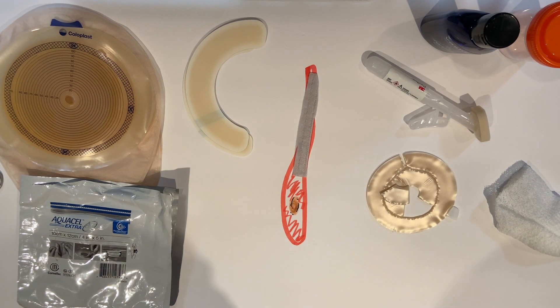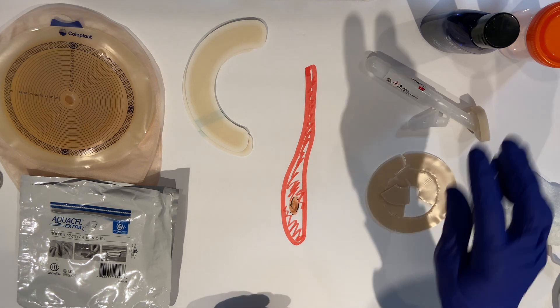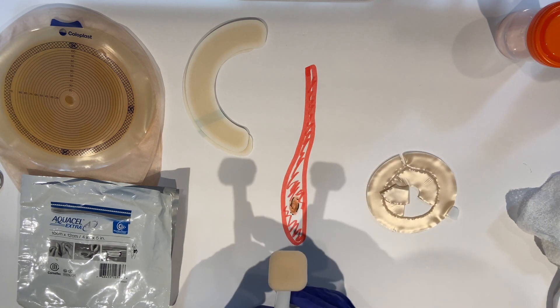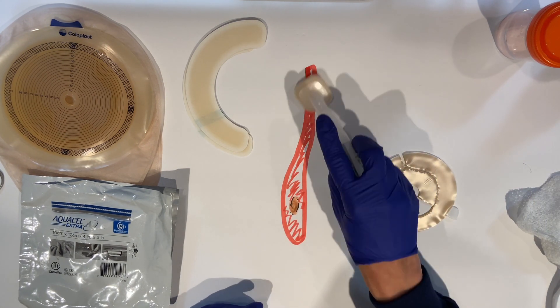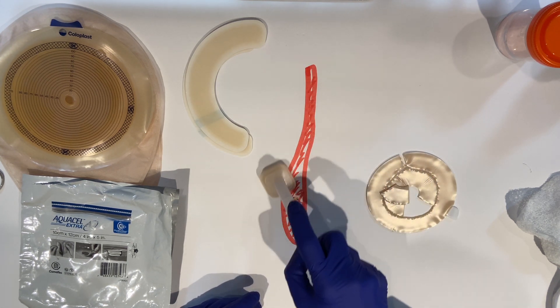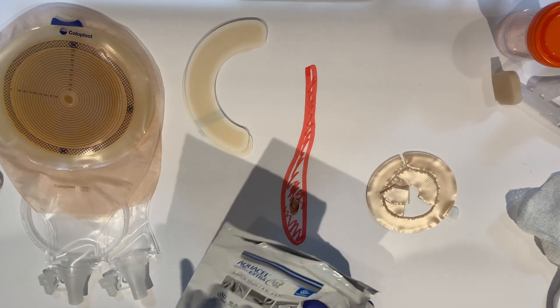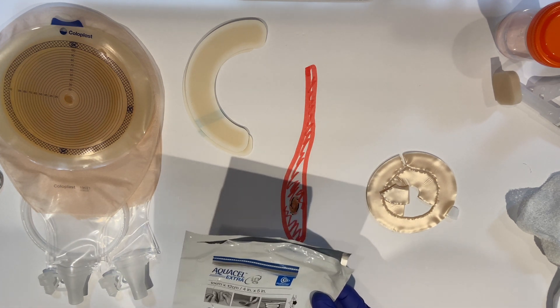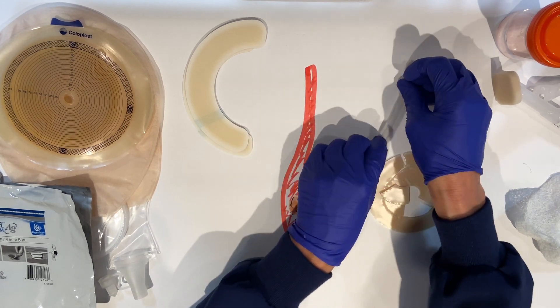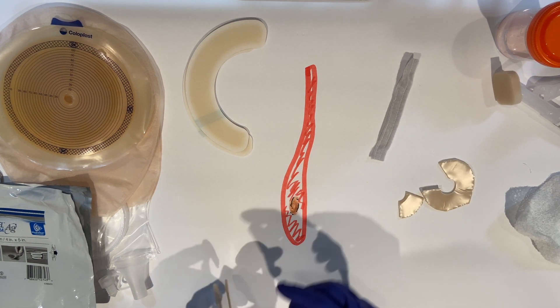Here's our patient today — you can see his little fistula and his big long incision. I'm going to scrub him up with Voshc because I love that, and then protect his skin with this wand. I love Cavilon Advanced — it makes a huge difference. You can put it right over the wound itself and it really helps to keep a seal and keep that wound edge protected. Then I'm going to use a long-standing silver dressing and cut it so that it lays right up through the wound. Then I'm going to cut my four-inch barrier rings just like I've done in the sandwich technique.